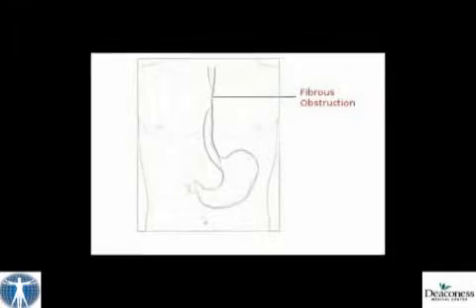Based on the initial endoscopic evaluation, the patient was set up for a repeat endoscopy with 2 endoscopists using 2 endoscopes simultaneously, one coming from above, the other one through the gastrostomy tube stoma from below. The initial plan was to trans-illuminate from above and advance a 19-gauge US FNA needle from below, guided by the trans-illumination. After successful advancement through the fibrous obstruction into the upper esophagus, a .035 guide wire would be passed through the FNA needle, received with a snare in the upper esophagus, and then pulled out of the patient's mouth to allow further interventions.